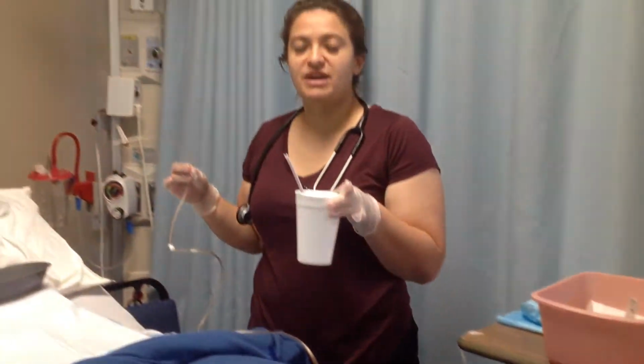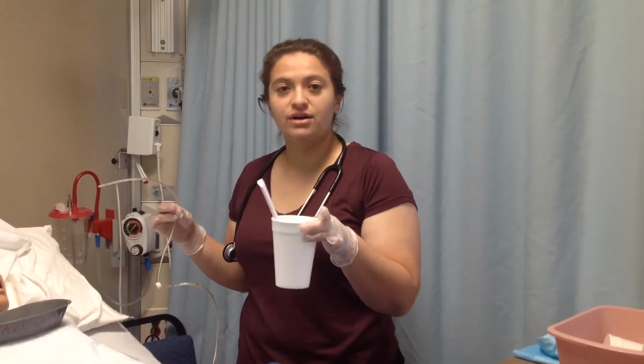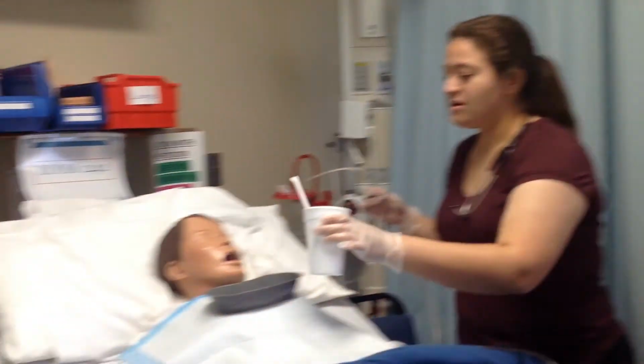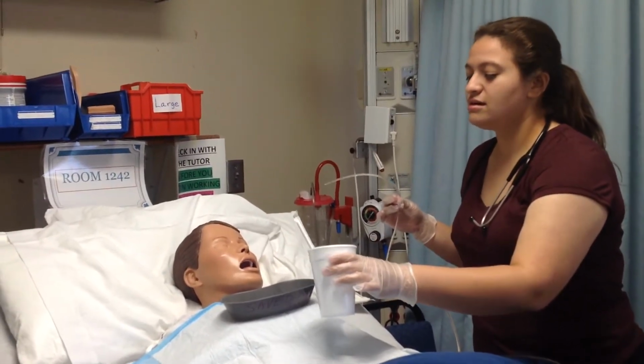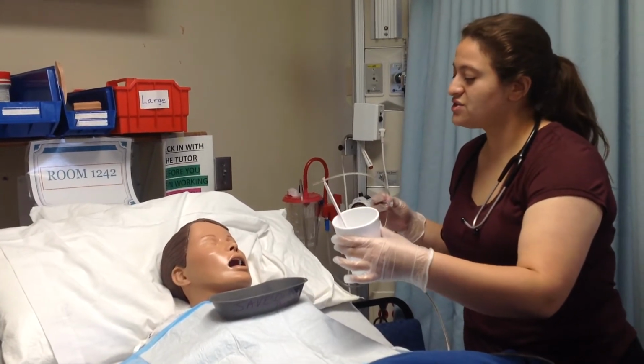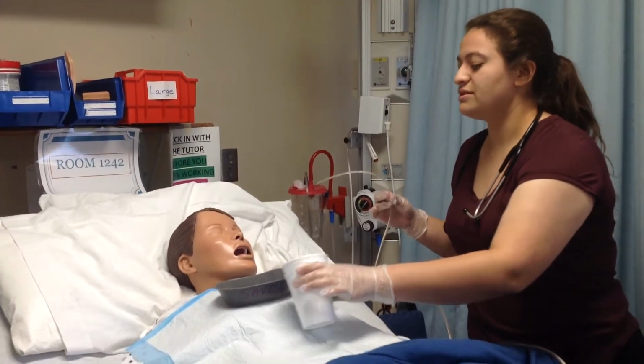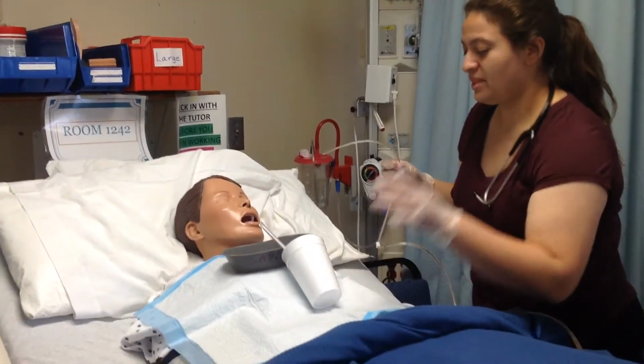And then I would also have the patient hold this cup of water with the straw. I would make sure that the wrapper's off, of course. And so this is just going to help you. You're going to start to swallow once you feel that gag reflex, but you'll do it once I instruct you to do so.